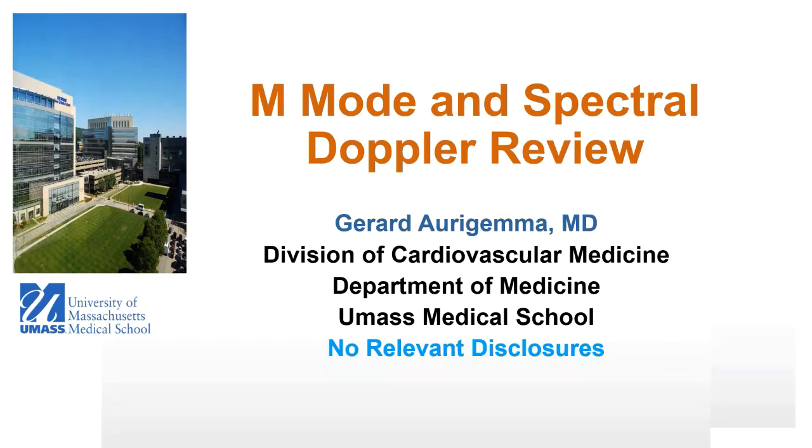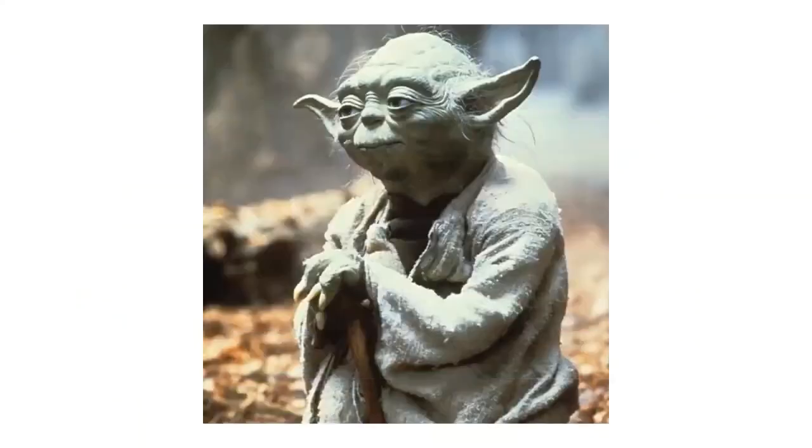And I would like to share with you my thoughts on M-mode and spectral Doppler for the next little while. You have to be old to really remember the early days of M-mode echocardiography, and I plead guilty to that. However, the more I learn about the more contemporary techniques in echo, the more I appreciate the insights that one gets from both M-mode and spectral Doppler recordings.